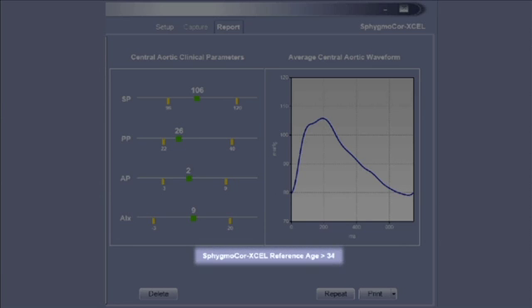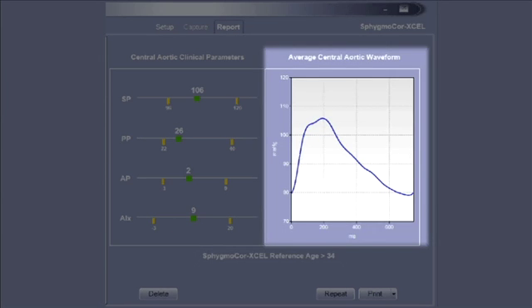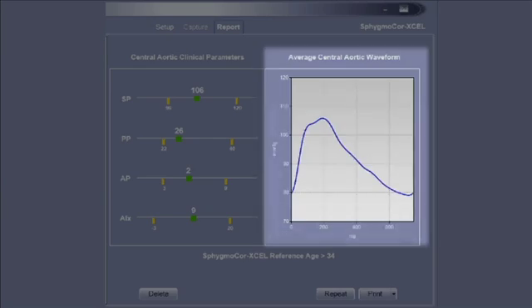The SphygmaCor reference age, an estimate of the age of the patient's arteries, as well as a graph of the patient's central aortic waveform are also displayed.